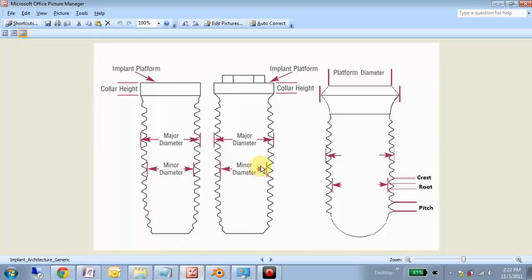Okay, so first we want to familiarize ourselves with the implant we're trying to model. Here I have a few generic implants that I've mixed and matched some different diagrams to just kind of demonstrate. I'm going to leave it as the responsibility of the user to find out the actual specifications of each implant. A few things to note is that the labeled length of an implant may not be its actual length. So it might be a 7.5, but in reality it's maybe 7.2.